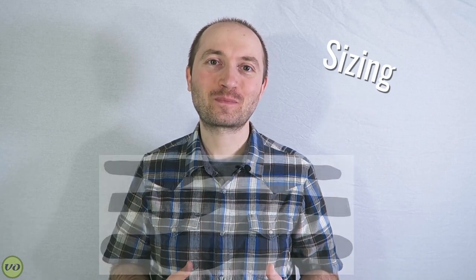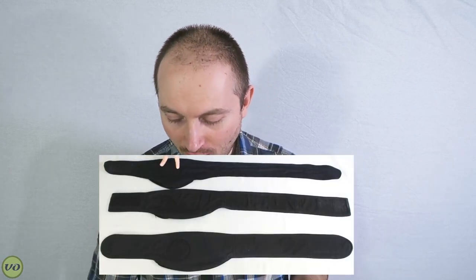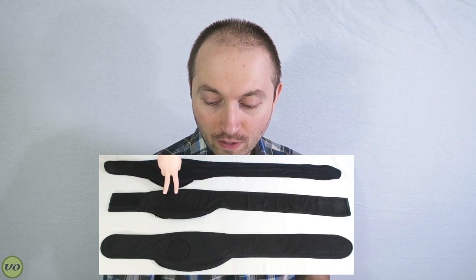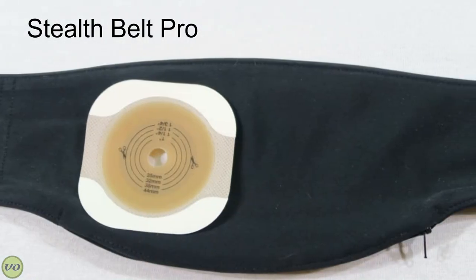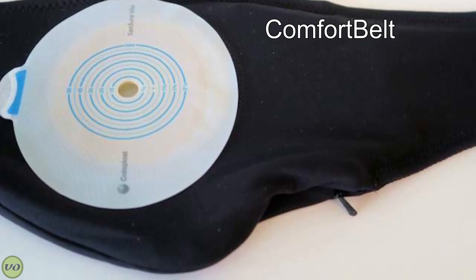Let's start with sizing. The Comfort Belt and the Quick Start Belt are both one-size-fits-all style belts, meaning it doesn't matter what size your flange is or whether you're wearing a one-piece or two-piece — they accommodate that regardless, because they have very large openings in the back where you put your ostomy bag through. The Stealth Belt Pro has a much smaller opening, which means it has to be sized exactly to fit your flange. For example, I like to wear two-piece systems, but one-piece systems have a larger flange base, so I actually wouldn't be able to wear the Stealth Belt Pro with those.